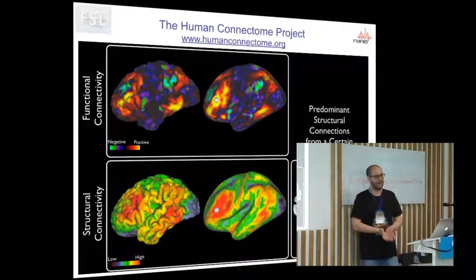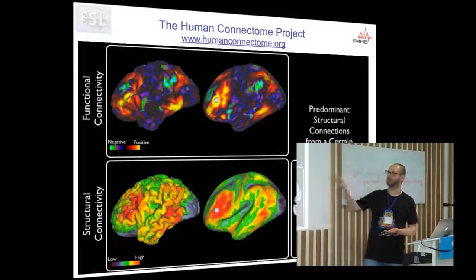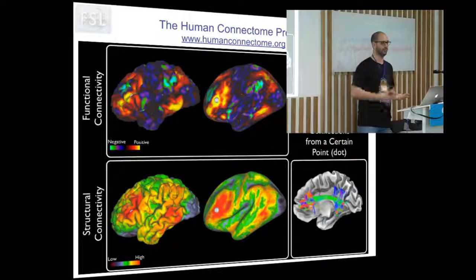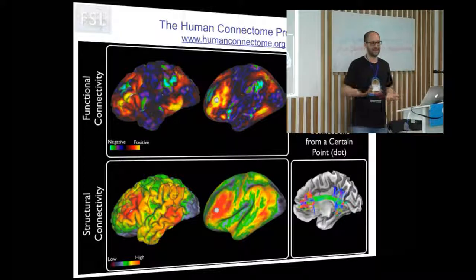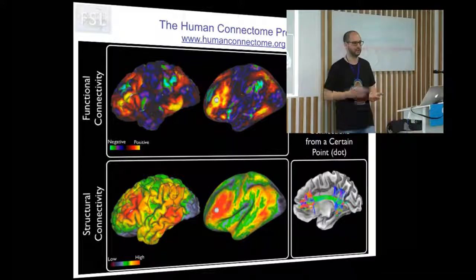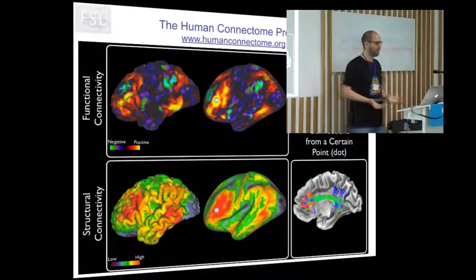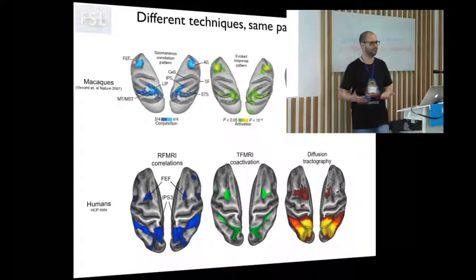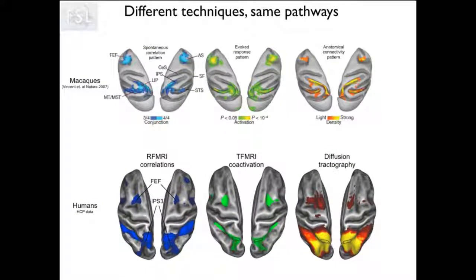What you can do to validate your results is, of course, also to use multi-modal approaches. Like in the Human Connectome Project, you can use the functional data to interrogate structural functional relationship, because basically areas that are structurally connected to each other should communicate with each other. But actually, because of a limitation of tractography and diffusion MRI analysis, you might get missing connections between two functionally connected areas.